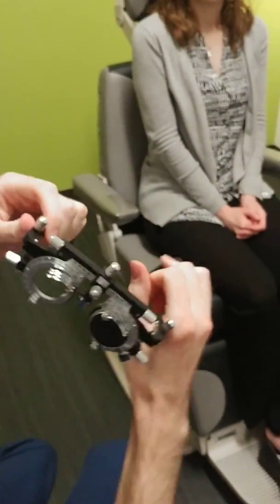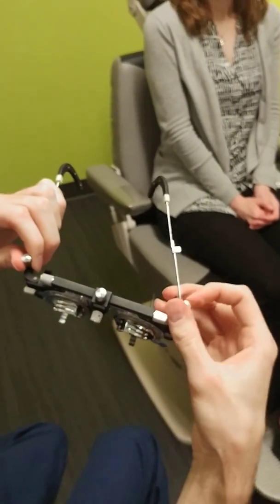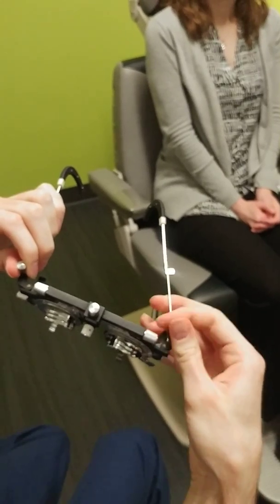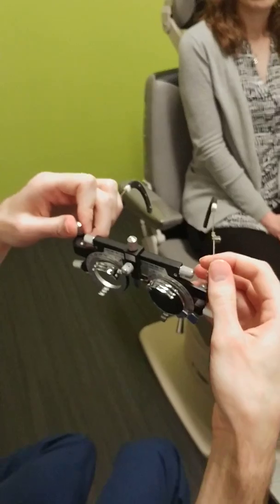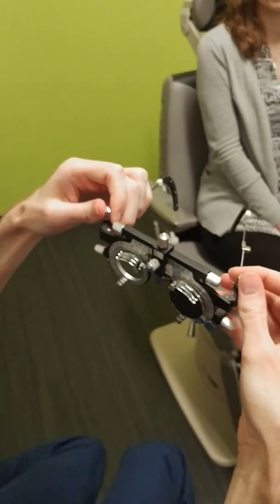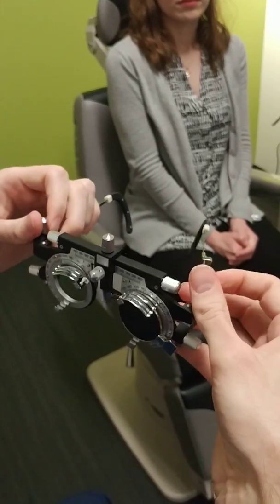Some other knobs you need to know are the knobs on the side. These actually move the temples up and down. These can be useful if you feel like the glasses are lopsided — if one side is higher than the other. If you feel like they're sitting too low, you can adjust the pantoscopic tilt by adjusting these knobs as well.